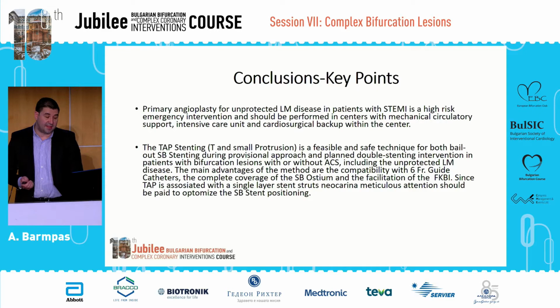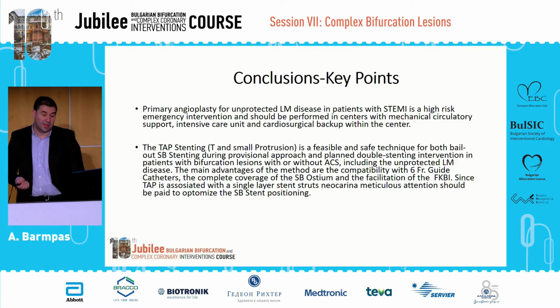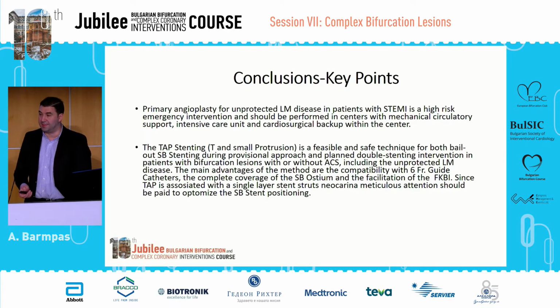The main advantages of the method are the compatibility with a 6 French guide catheter, the complete coverage of the side branch ostium, and the facilitation of the final kissing balloon inflation. Thank you very much.